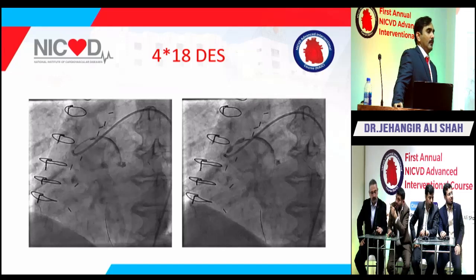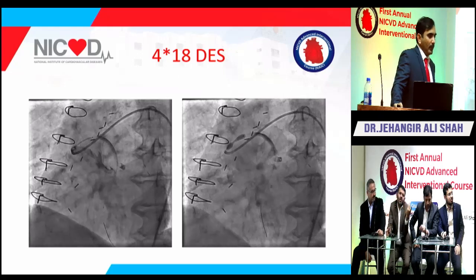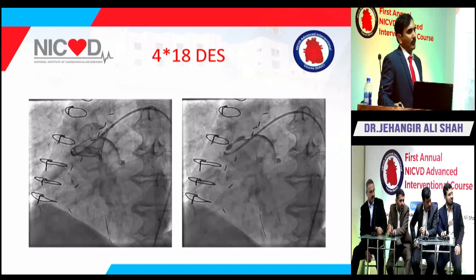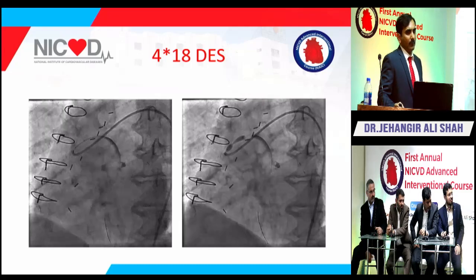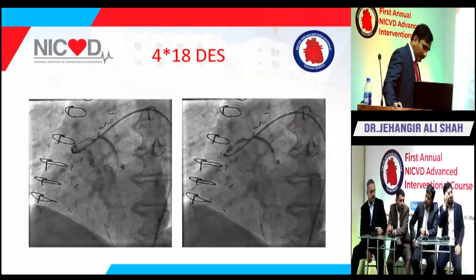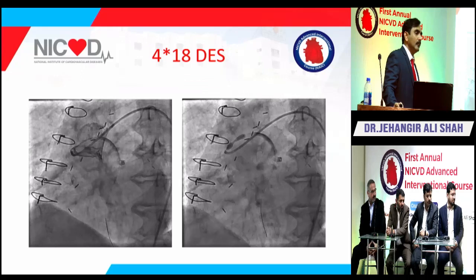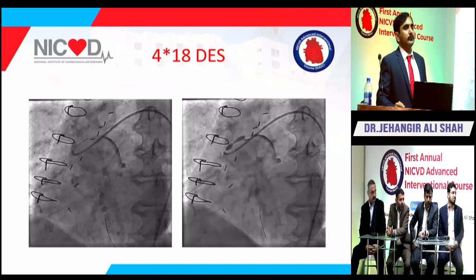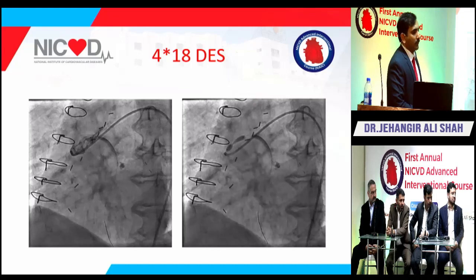But the more important thing, and I agree with Jahangir, I would rather pull the stent back 3, 4, even 5 millimeters in the aorta than miss it. Because again, the highest risk of restenosis is with missing the ostium, because that's aortic tissue that has a lot of elastin in it. These are all open cell designs. They don't have supportive ladders as they used to initially, so the stent tends to collapse. So you would rather have more stent out than in. And you don't want 2 layers of stents in the ostium, because that's an ideal recipe for failure. And for this guy who's relatively young, he's living off of this.